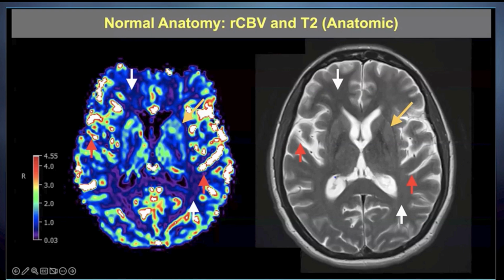And we can see here that in general, the rCBV values are quite low. We can see here that they correspond with areas of blue and purple. And even though there's some heterogeneity, we generally record the measurements from a region of interest, or so-called ROI, that averages across this area. And it provides a good baseline of what we consider to be normal appearing white matter, or you might see in the literature NAWM. And that basically just gives us an internal reference.